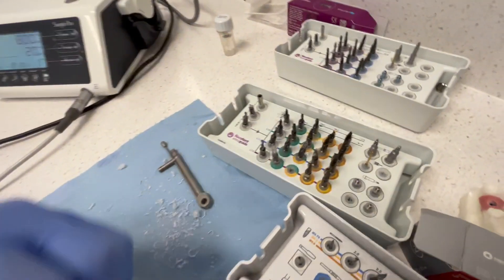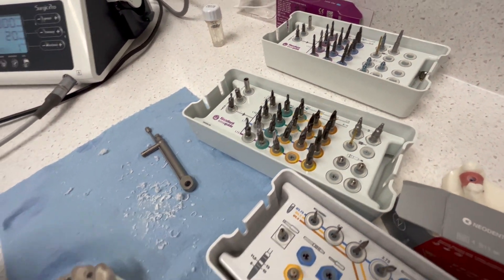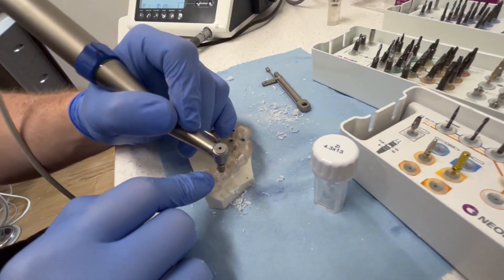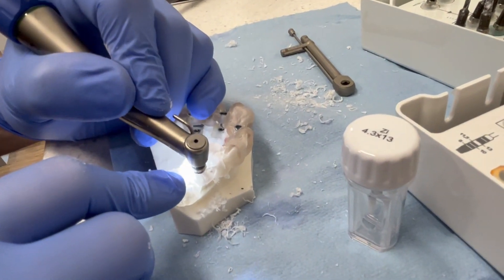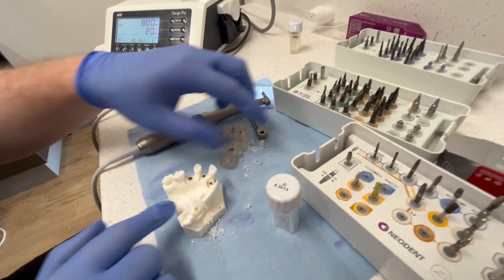And now we're going to go to our 4-3 for hard bone or 5-0 for soft bone. Since we're in like a D1 model here, we're going to go to our hard bone 4-3. And now we are done drilling our osteotomy.